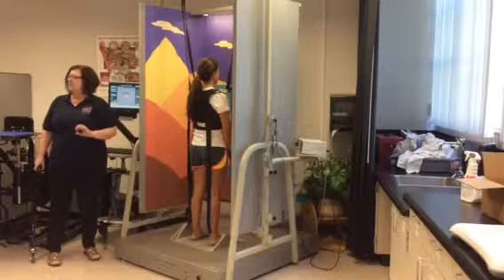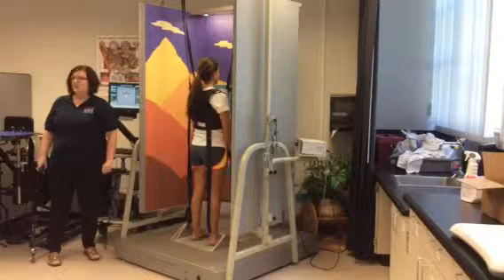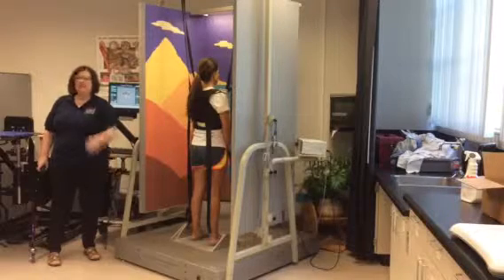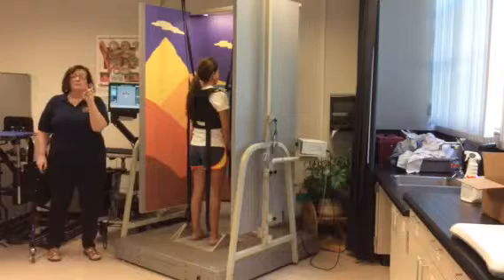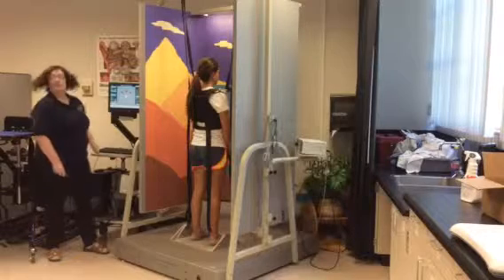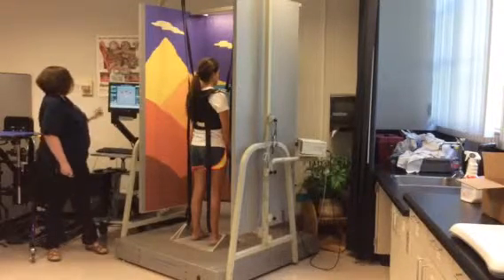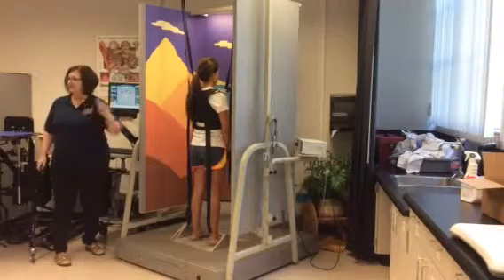Do you think that's going to be too easy or too hard for her? Too easy. But is 100 too hard for her? Maybe 80. Let's try 80. It's not a perfect science, but you start intuitively, okay? And so we're going to make those targets, watch this, 80% of her available limits. So that's the task, an anterior weight shift.